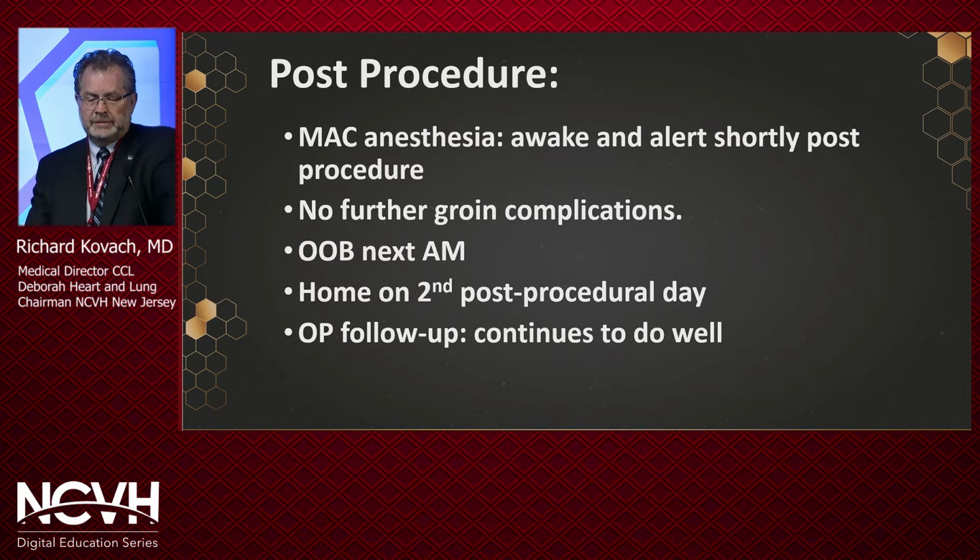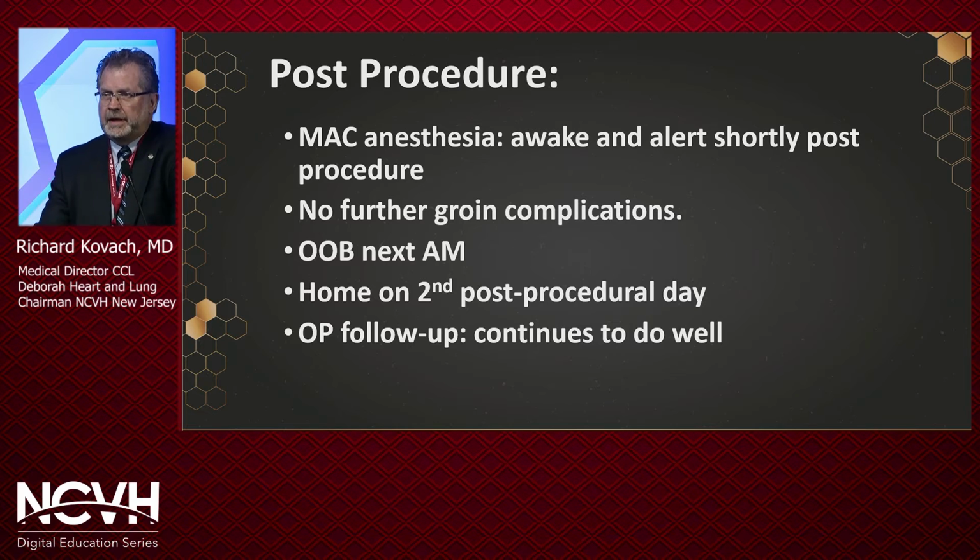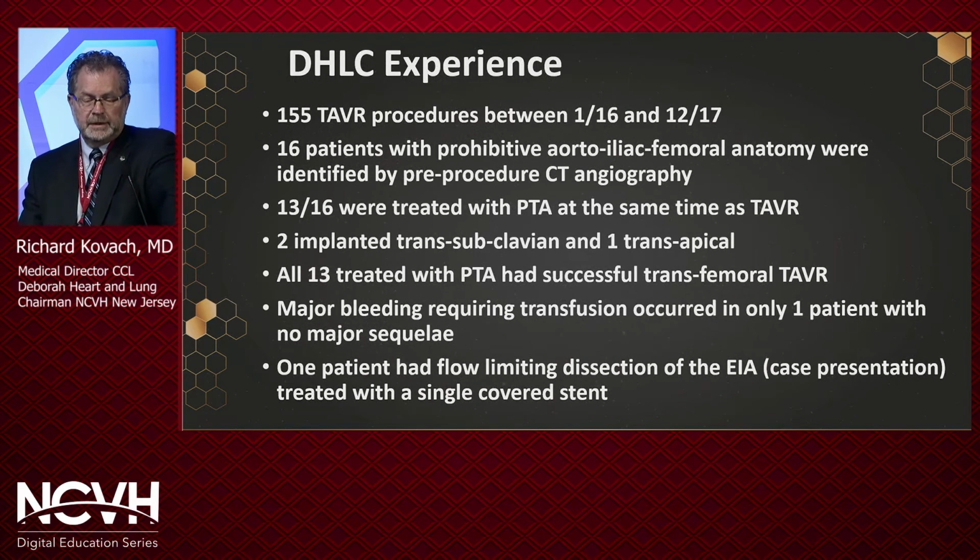Post-procedure, the patient was awake very quickly, with no further groin complications. She was out of bed the next day and home on the second post-procedural day. And in follow-up, she continues to do well.